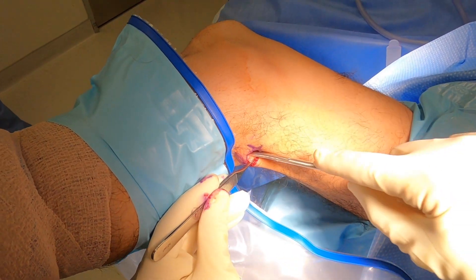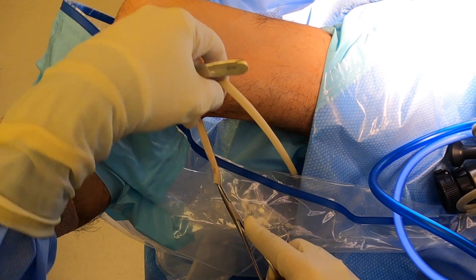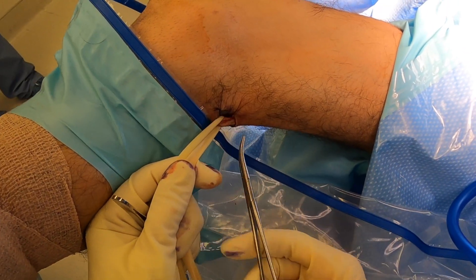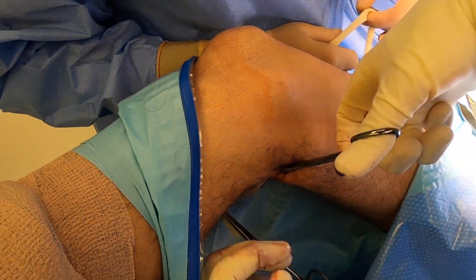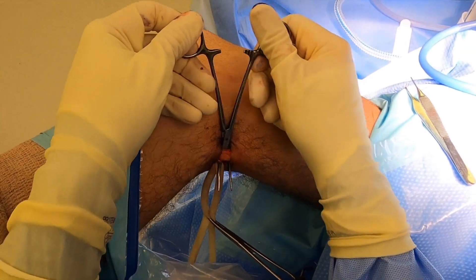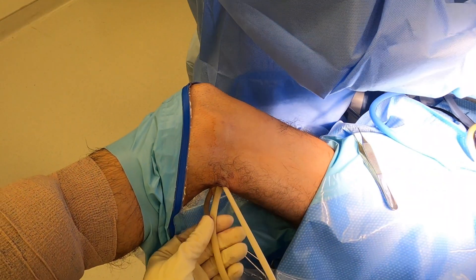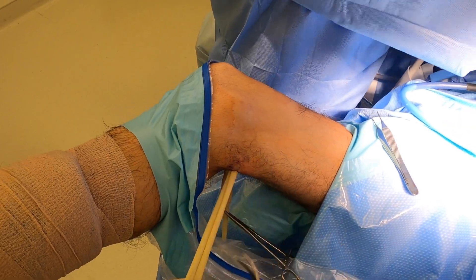Here you can see after separating the fascia I can immediately get underneath the tendon and expose it bluntly. I'll pass something to tag the tendon — here's a Penrose — free up the tendon a little bit, and then immediately one centimeter medial you will always find the gracilis. Although I don't expect to use it, we want to tag it now since it will be difficult to find later once we remove the semitendinosus, so I keep it there as a backup measure.